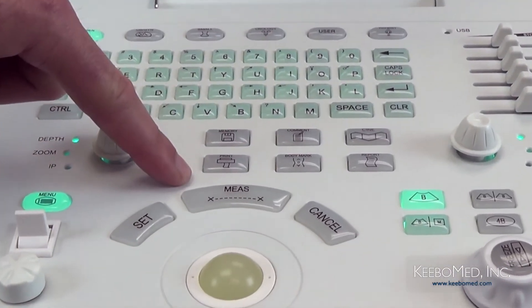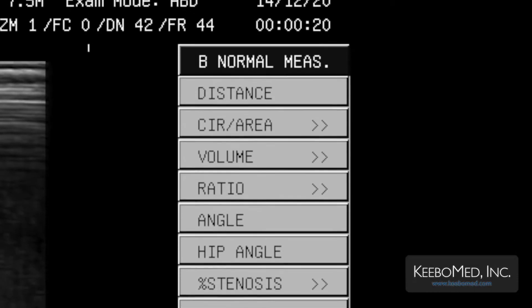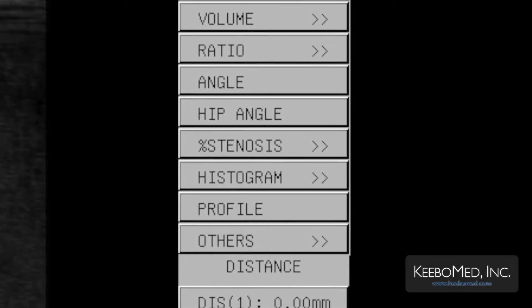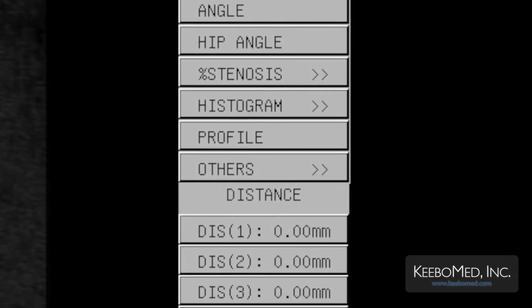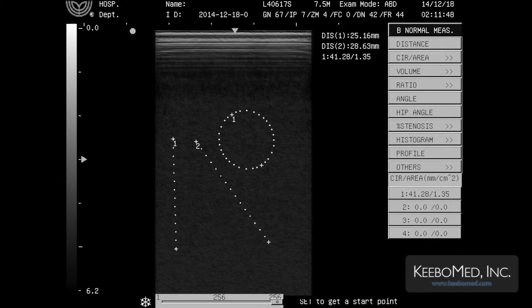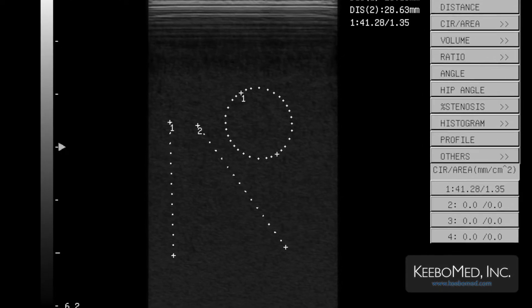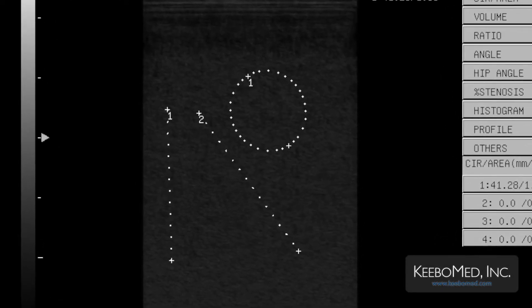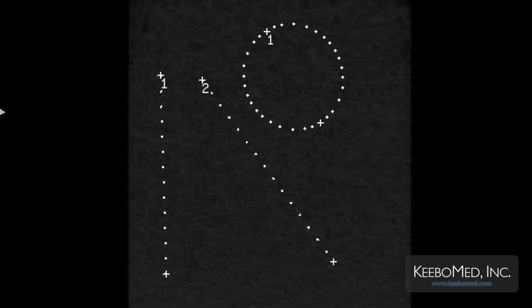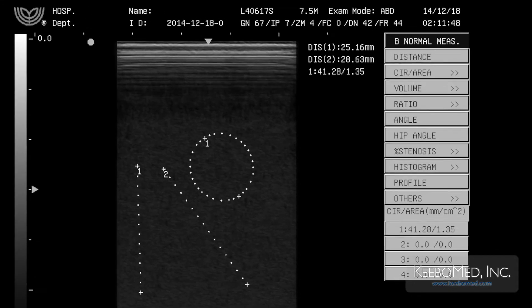The key in the middle is used for making measurements. Pressing this key will bring up a menu with different measurement options that can be selected. It will also allow actual measurements to be taken on an image. First, a crosshatch is shown on the screen. Then select a starting point using the set key, move the trackball to the end point and press set again. The measurement will then be displayed on the screen.